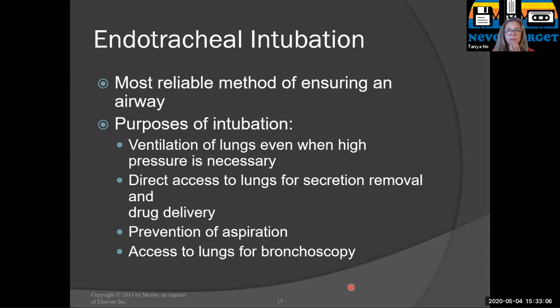That being said, there is this thing called microaspiration, and there's aspiration happening all the time. All those secretions that are sitting above the cuff, they have little grooves. If you look at the cuff with a microscope, you'll see it is not completely flat and sealed straight up against the airway. There are these little grooves, and bugs and little secretions can slide down around the outside of it. So it doesn't really prevent aspiration, but perhaps gross aspiration. If they vomit, it can be caught above the cuff. But there's microaspiration, aspiration happening pretty much all the time.